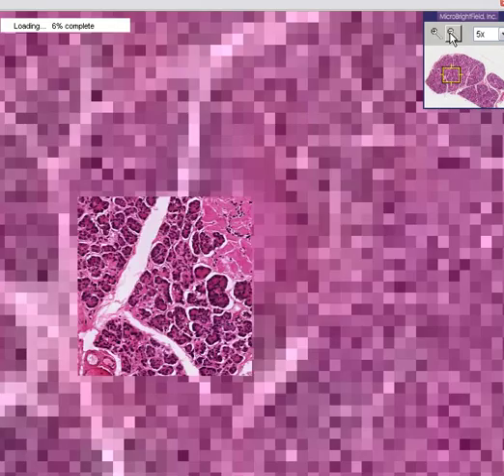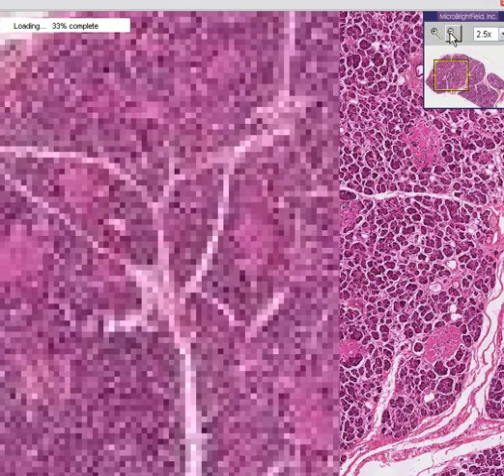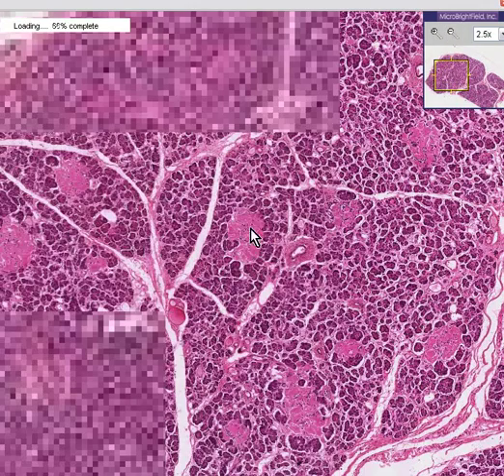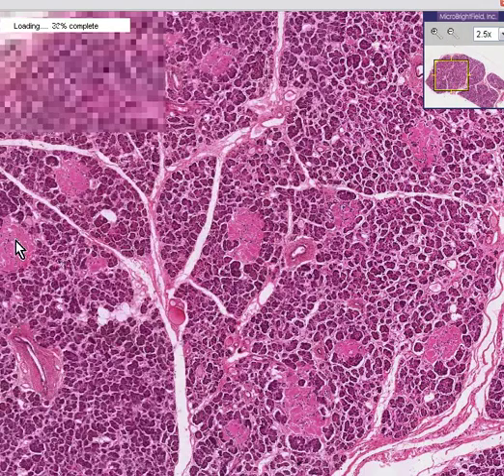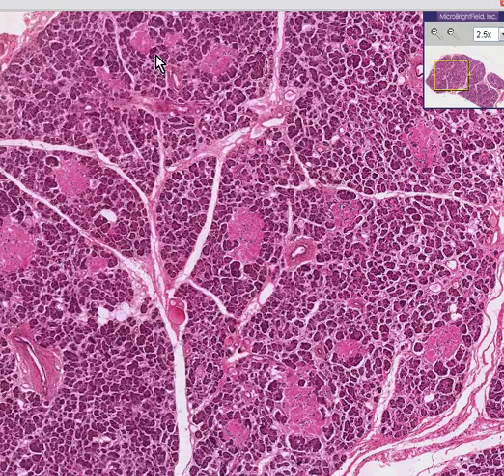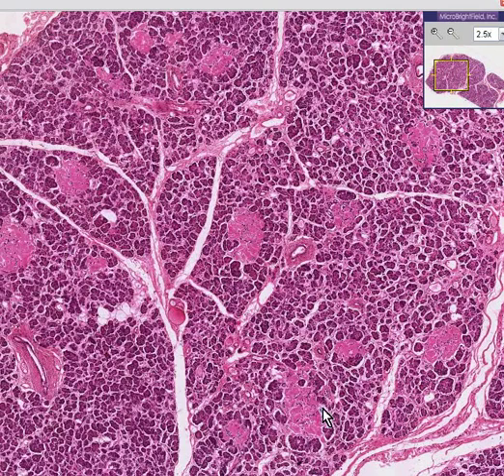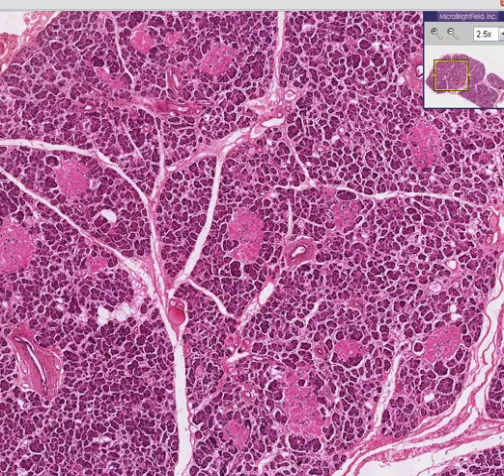What disease do you think this patient might have because all of these islets are hyalinized? Yes, you guessed it — diabetes.